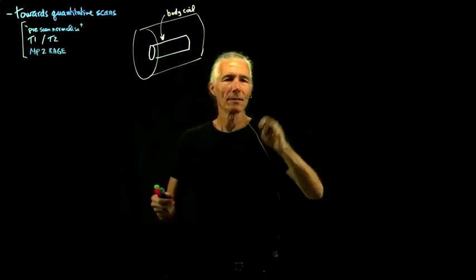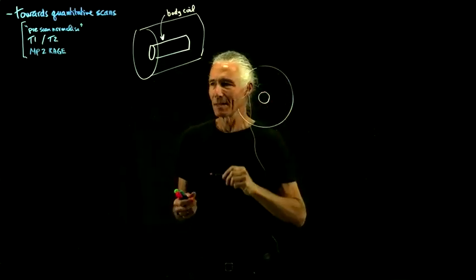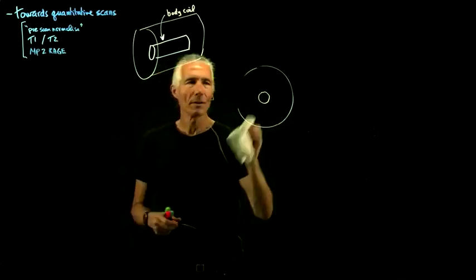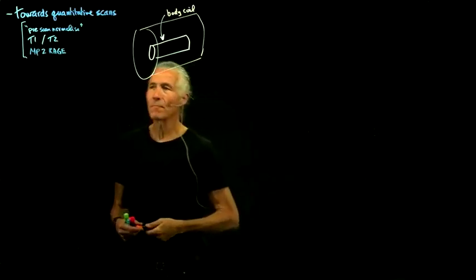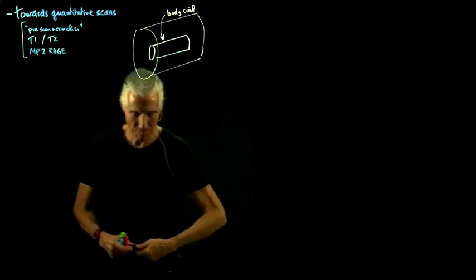The body coil is a big coil like that, and you've got this little head inside of it, so it's not going to have this coil fall off problem. And so you just record a quick and dirty image from the body coil.